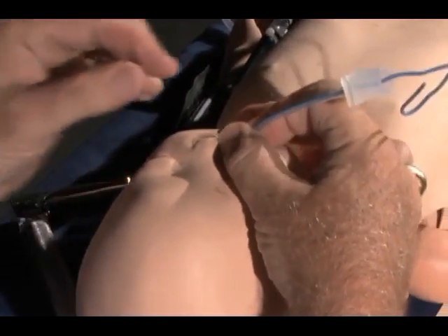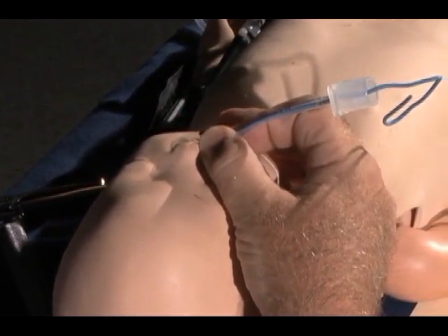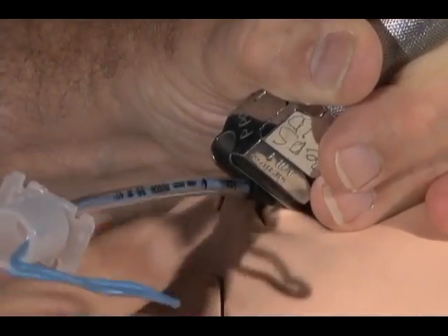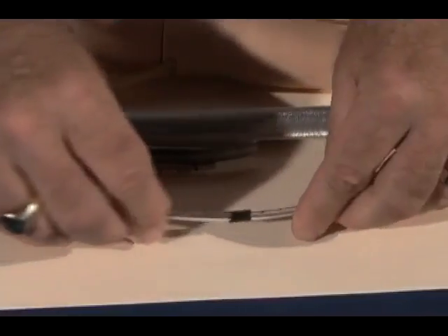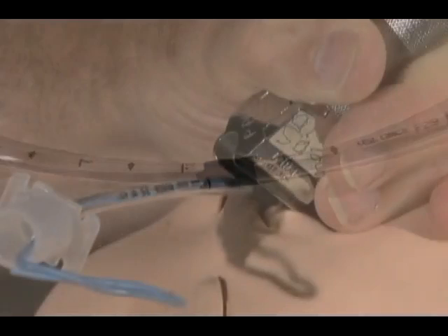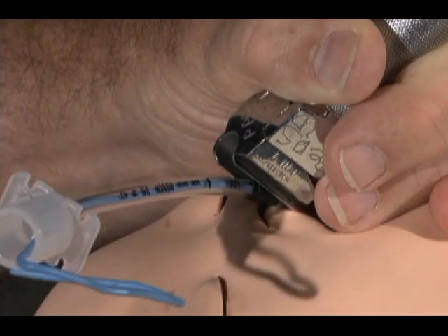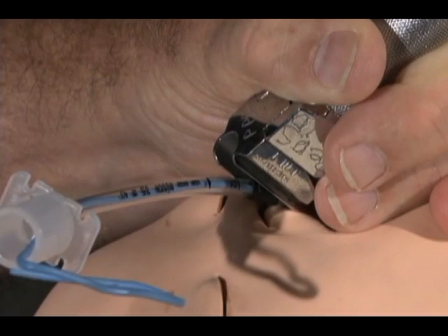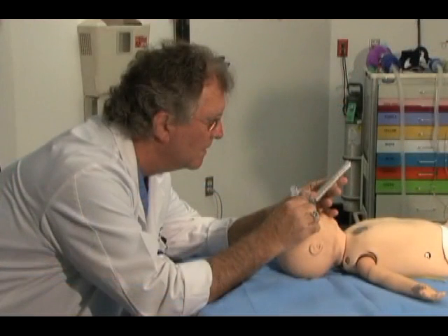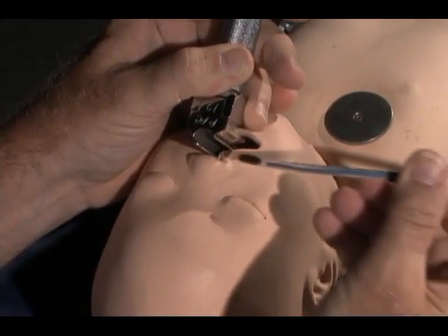The thumb and fingers should keep holding the tube, preventing movement until it is secured. Also note that the tube was inserted up until the tape portion — remember we placed a piece of tape at the lip-to-tip distance. With the tube secured at this level, the tip of the ET tube should lie halfway between the vocal cords and the carina.